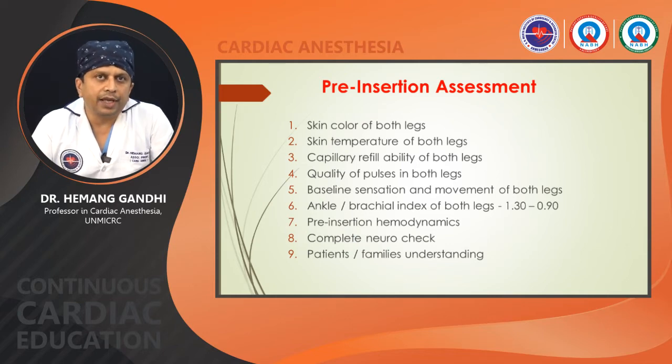Also see the pre-insertion hemodynamics of the patient. Complete neurological assessment of the patient is required, and most important, you should counsel the patient or the family regarding the effect of IABP and the complications associated with this IABP.